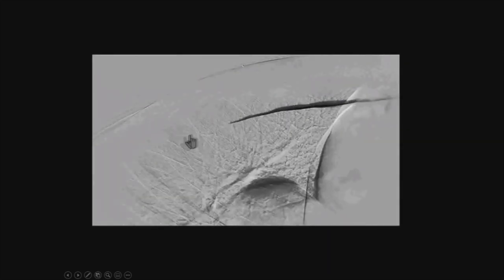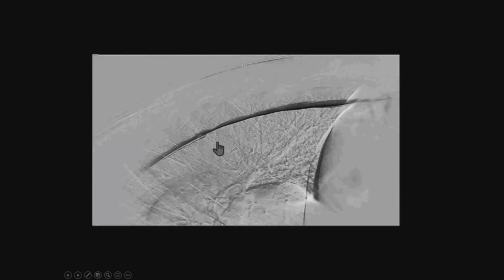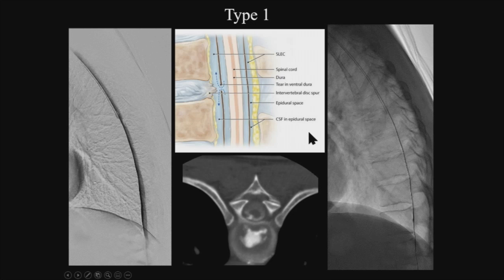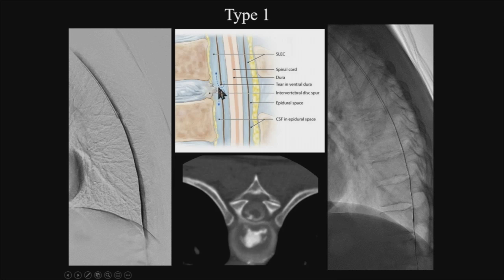This is that 50-year-old lady. You can see the typical appearance of the double-pants sign, where both legs fill out instead of just one all the way down — and that's where the hole is. We've called this the type 1. Our classification system is very similar to Wouter's, but even more simplified so I can classify people quickly and move along in our imaging chain. The drawing from our paper — done by our medical illustrator Wendy Gu — shows a small spur or degenerative disc that has grabbed the dura and created a hole in it, either via a small calcified spur or by tearing the dura when patients cough, lift, or sneeze.